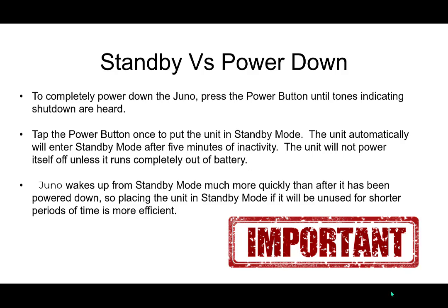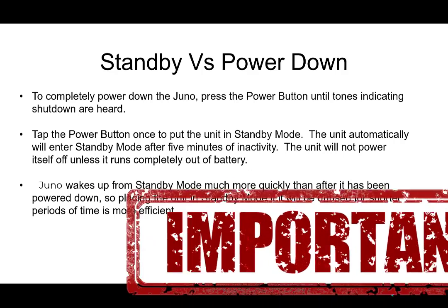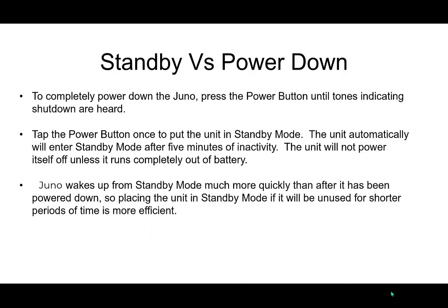So one thing I'm very careful to tell people is if a student leaves it on their desk in standby mode, it's still using some power. It's not using as much power, but it's still using some because it's available to be woken up really quickly. So that student may come back the next day to either a dead unit or a unit that is pretty low on charge. So that's important to know. It's not something you want to leave permanently on standby, they're going to want to shut it completely off when they're going to be gone and away from it for a length of time.